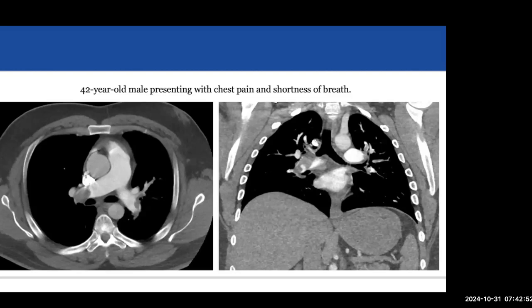The options would be catheter-directed thrombectomy, which would give an immediate relief for this patient. The second, thrombolysis, which is medical, but it might take time.